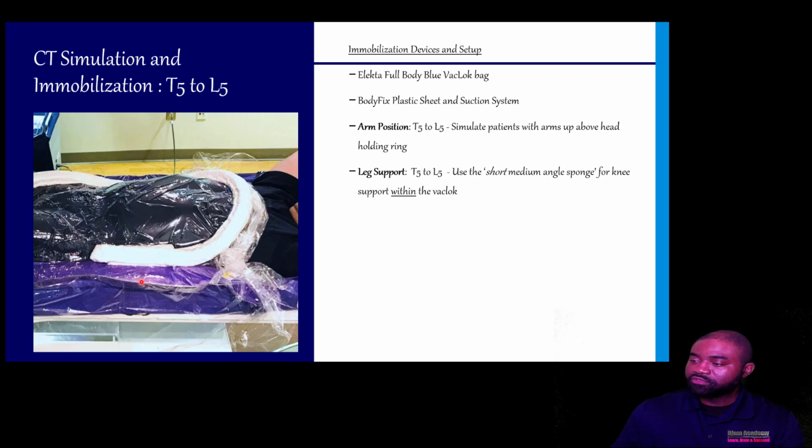Now, the vacuum plastic shield essentially is to lock the patient in place and to prevent fidgeting or movement as much as possible.